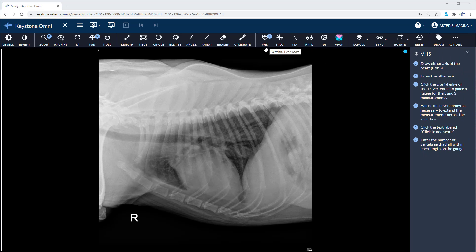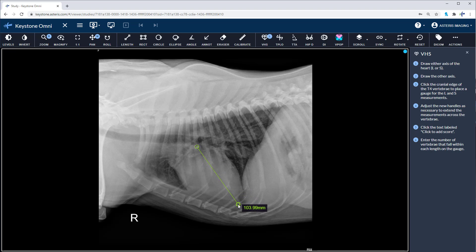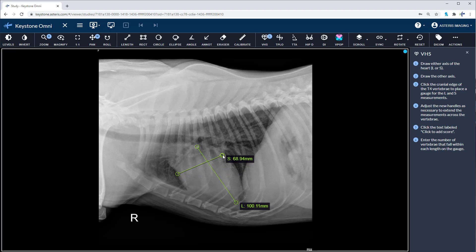Start your measurement with the long axis from the carina of the mainstem bronchus to the apex of the heart. Follow with the short axis measurement, starting at the widest part of the cardiac silhouette, perpendicular to the long axis measurement.